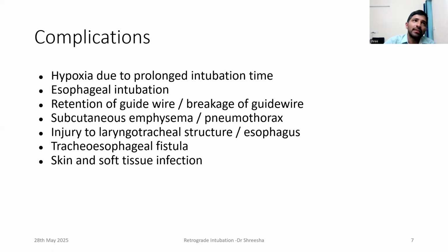In one case report, it was shown that in a regular retrograde intubation, the guide wire actually broke and the patient presented with dysphagia after 2 years. And at that time, it was detected that a piece of guide wire was still in the neck tissues.